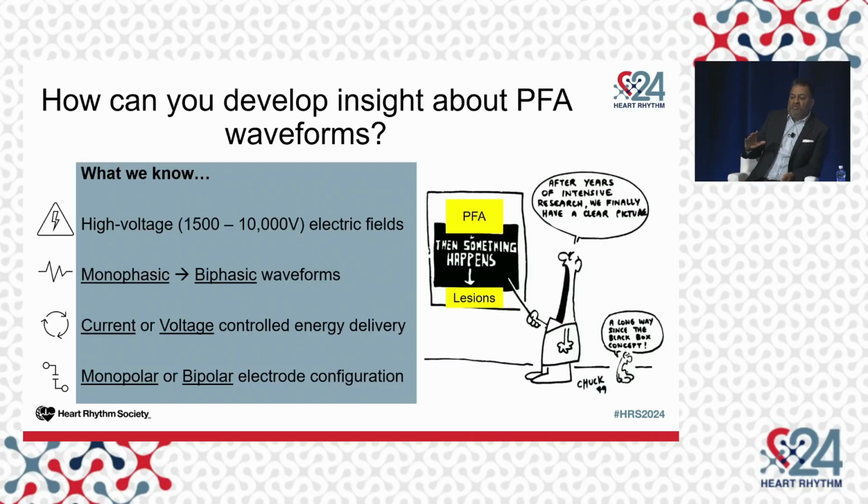But just looking back, the way most people think of PFA is that cartoon where PFA happens, and the next thing you know, you have a lesion. This is one of those energies that has reached a clinical space without us really explaining it and educating our colleagues and really having a deep understanding out in the community.